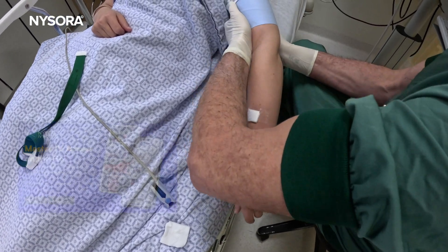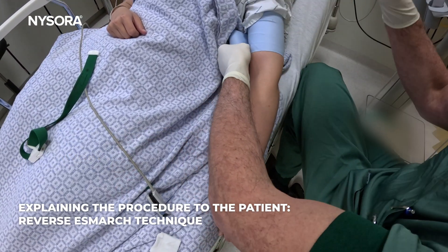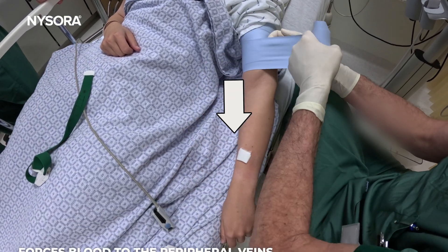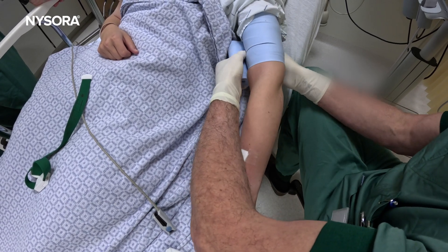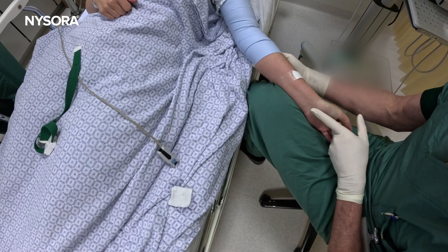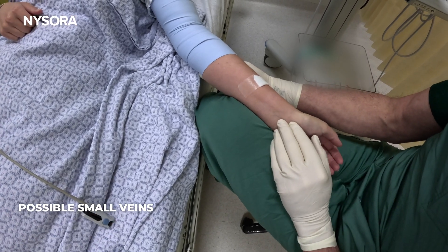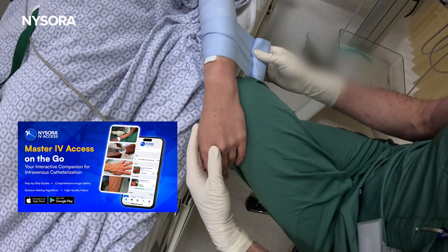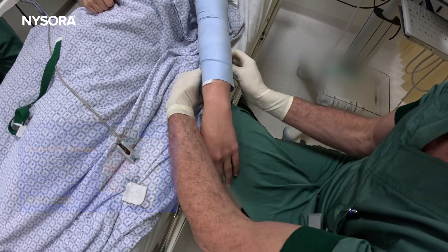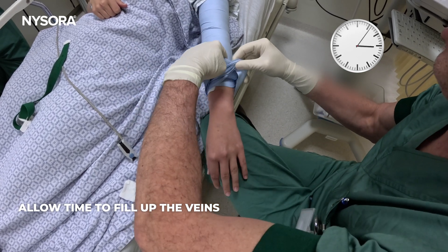So we're going to squeeze this a little bit. What this does is it forces the blood from your big veins down to the periphery, and that helps small little veins on the surface come up. We already see some veins that are popping up — it's all workable. So exsanguination is number one. Number two is allowing time for the veins to pop up.